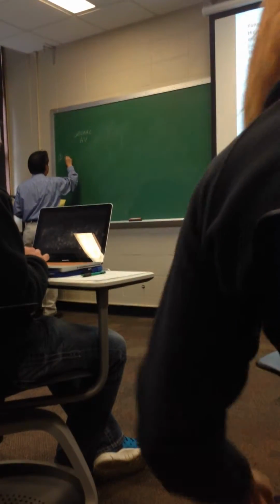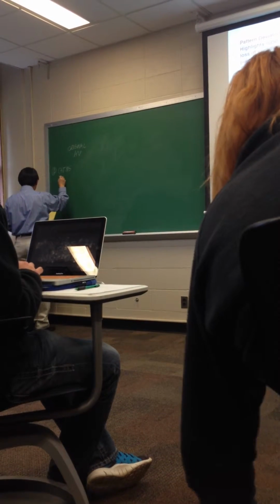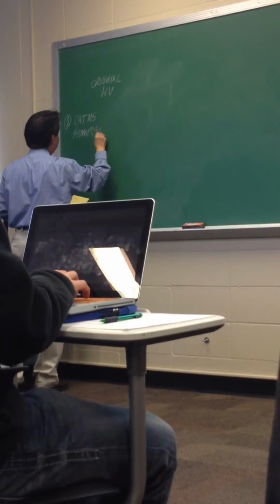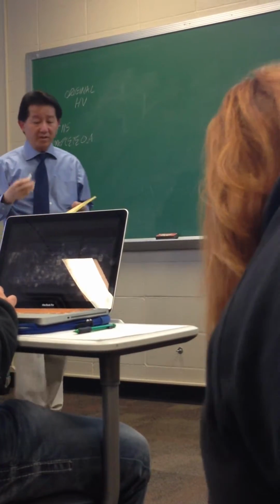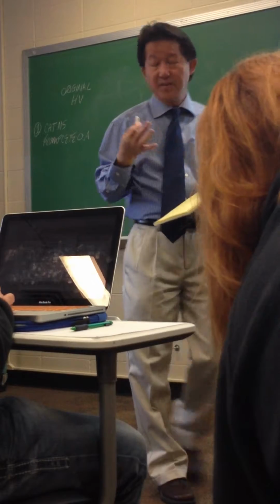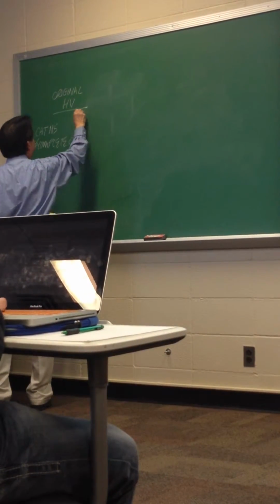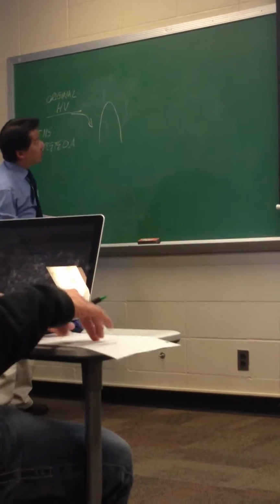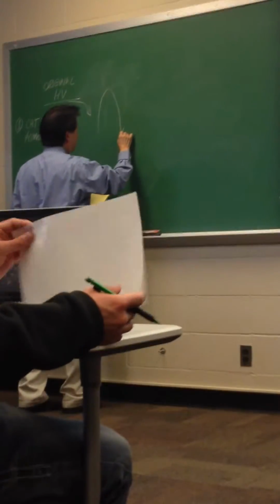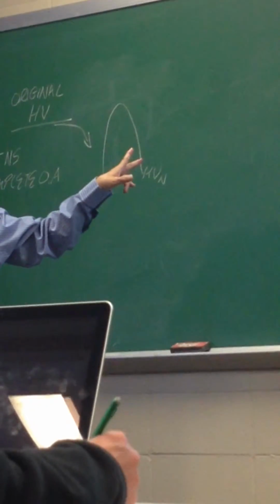This would be maybe a cataract, or say a non-complete optic atrophy. So you've got pallor of the disc, but it's not complete, so there's still vision. So you've got your norm. This is your hill of vision, your normal hill of vision for that age-matched hill of vision.